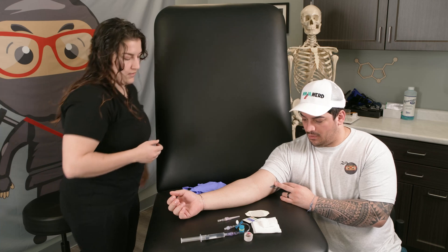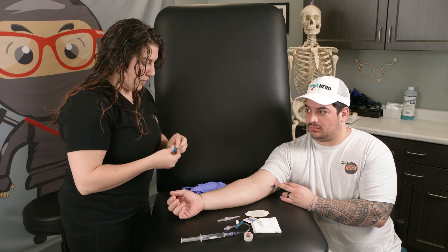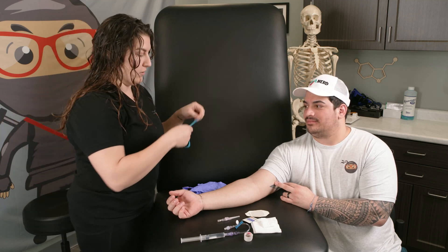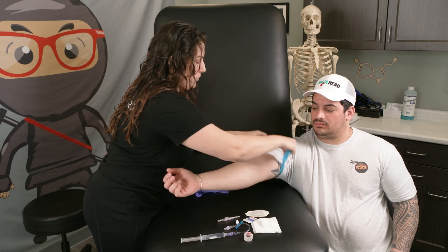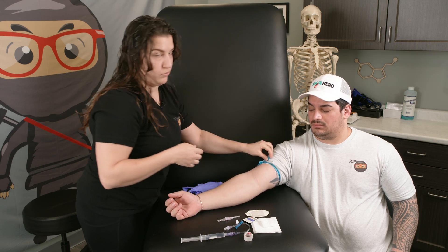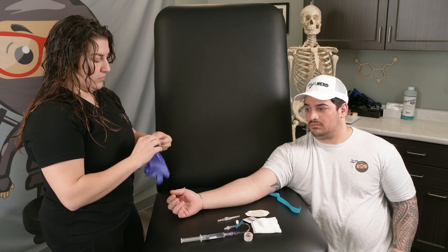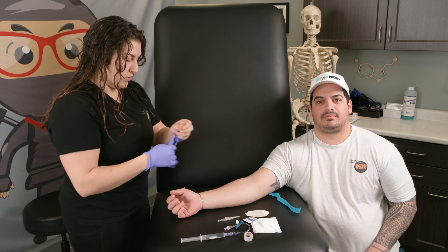Now what we're going to do is have the patient in a position that they're comfortable in. We have the arm laid out and I'm going to put the tourniquet on. When you apply the tourniquet, you want to make sure that it's tight, applying pressure, and you want a quick release so that later we can release it with one hand. I'll leave that there, comfortable, because you don't want to leave the tourniquet on for too long.